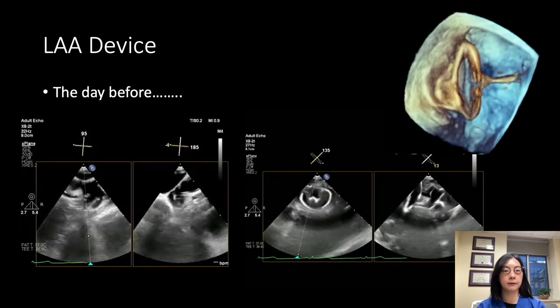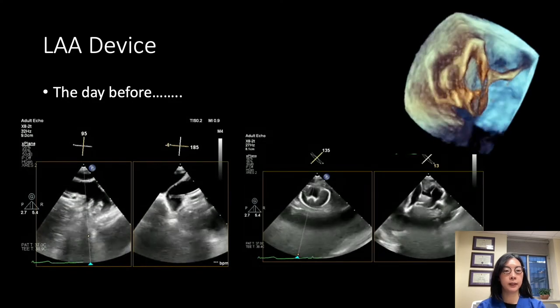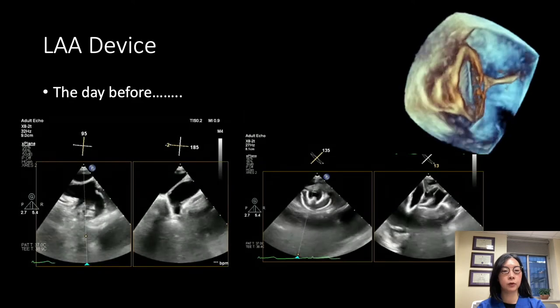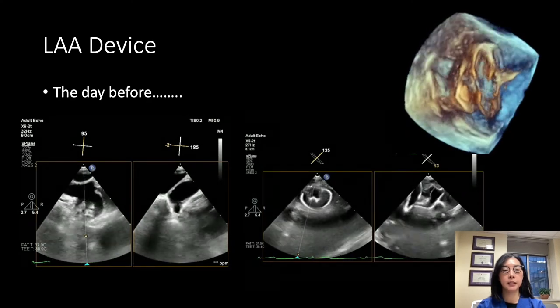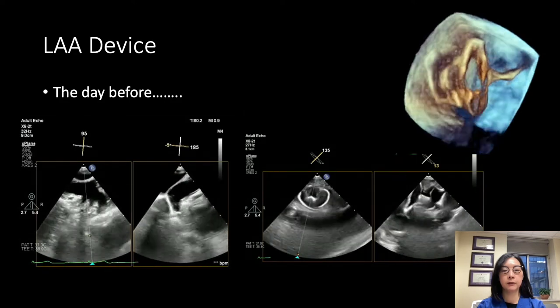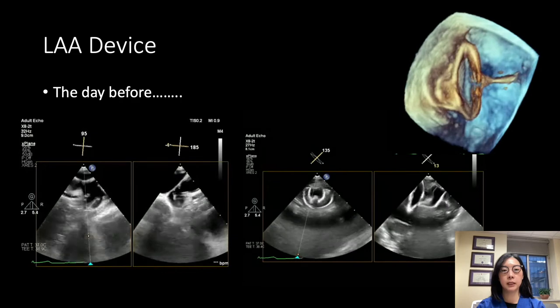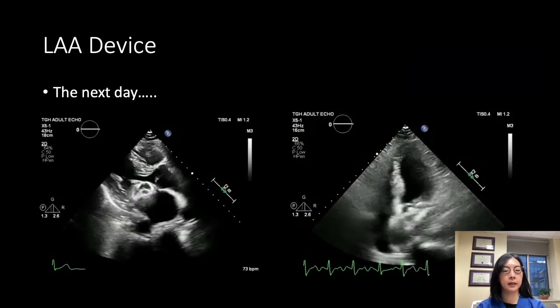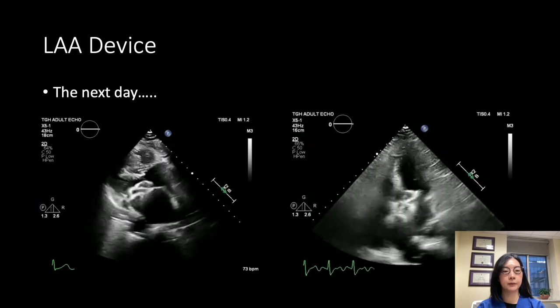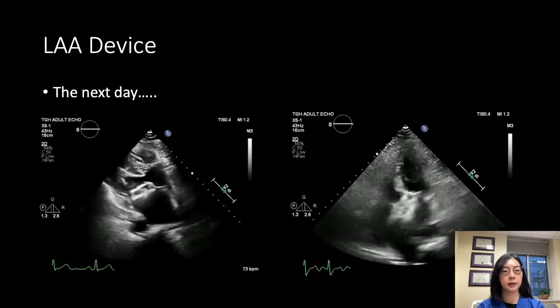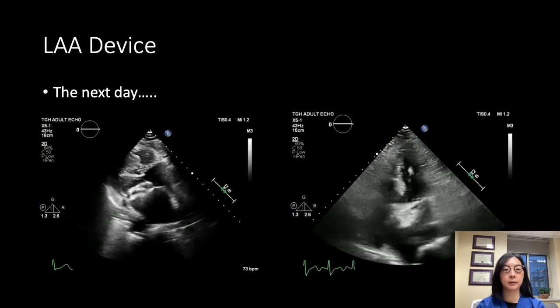This final case involves a left atrial appendage with an almost claw-like shape with multiple large deep lobes visible on the left image. On the right, a device has been placed and we're cutting through with biplane to check placement — the device doesn't look like a helmet, doesn't look very squeezed, looks deep and well in place. On 3D, there's no movement on tug-test so it appears in a very good position. Unfortunately, the next day the pre-discharge transthoracic study showed the device had dislodged and was stuck against the mitral valve, causing arrhythmias. The patient was not discharged.